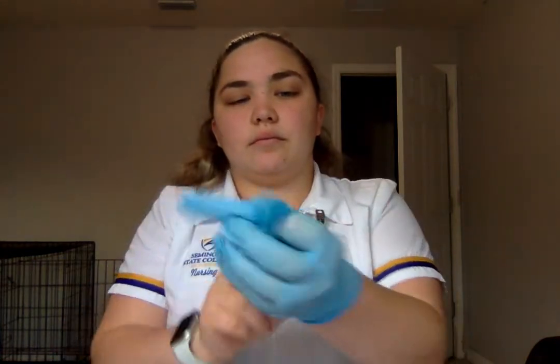So then once she has all the injections given, I'm going to monitor her sites, make sure they don't have any adverse reactions like swelling or redness or anything like that. So I'm going to monitor her injection sites. And then while I'm monitoring her, I'm going to go ahead and remove my gloves. I'm going to perform my hand hygiene. I'm going to throw all my trash away. Then I'm going to go ahead and document that I gave the medication.